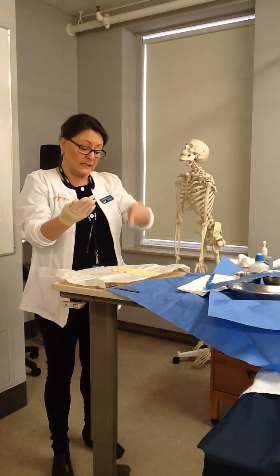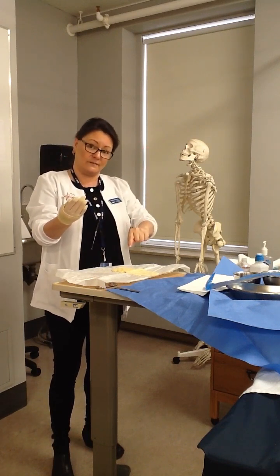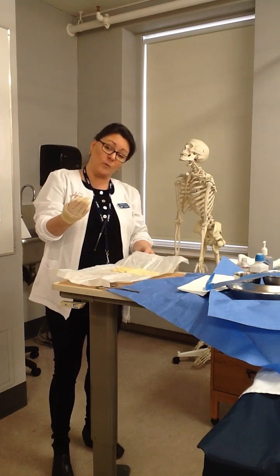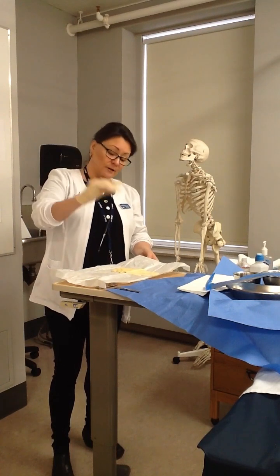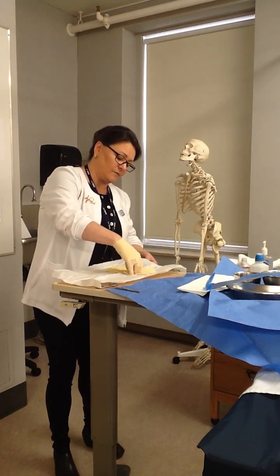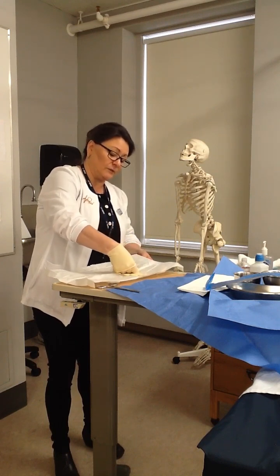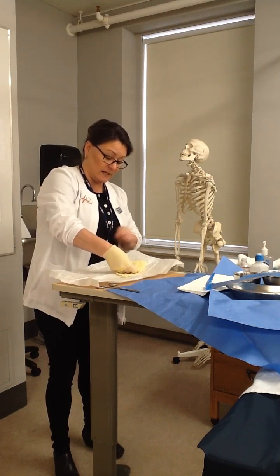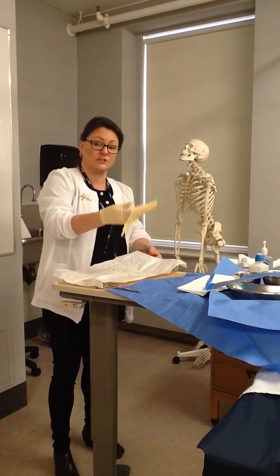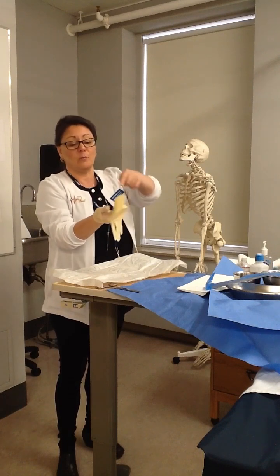Now sterile can touch sterile. So this unsterile hand can't touch this glove. I'm going to reach my hand over here and hold on to the unsterile border on my package. My sterile fingers are going to reach down and loosen that cuff enough that I can get all 4 fingers under that cuff. I don't let the glove come into that outside unsterile border. I reach my fingers in and pick it up off the package, and I'm going to just move my fingers enough to make it open.